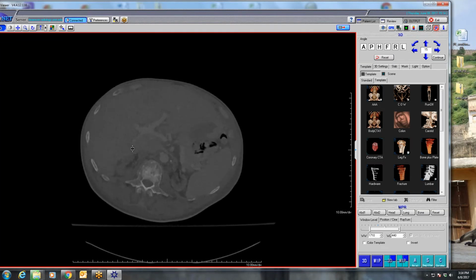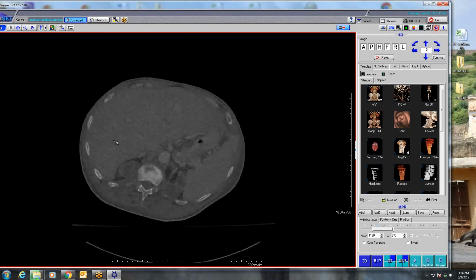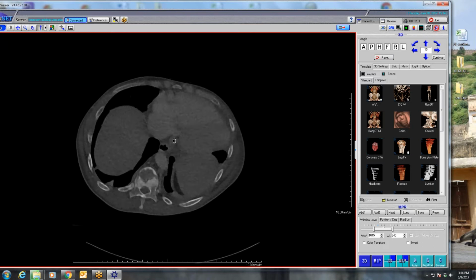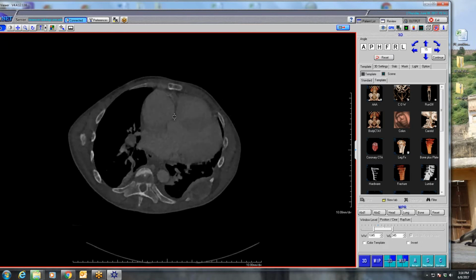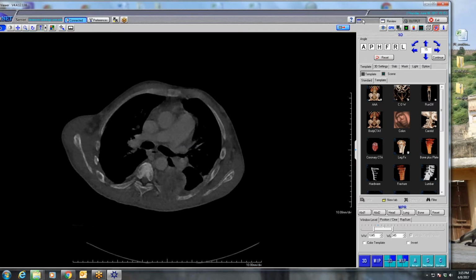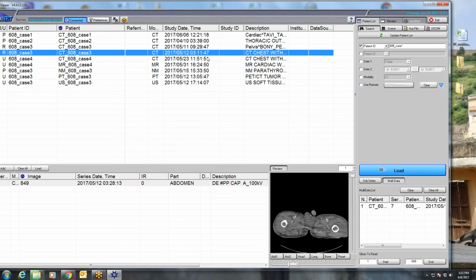He literally was some homeless guy on the street, no history, and it's not clear what the cause of the renal disease is. I don't know if it was developmental. I have no idea. But yeah, I've not seen those before. Spectacular.